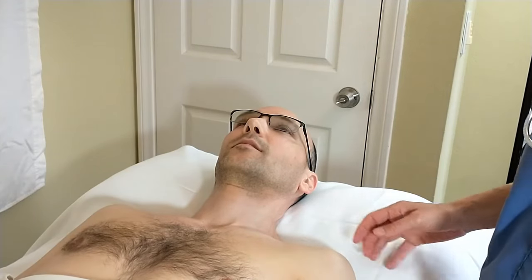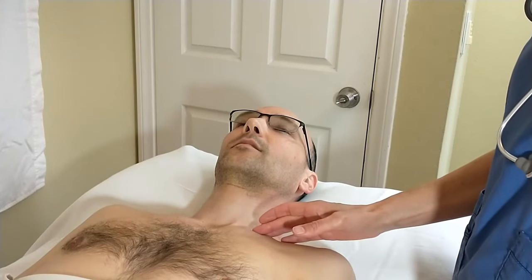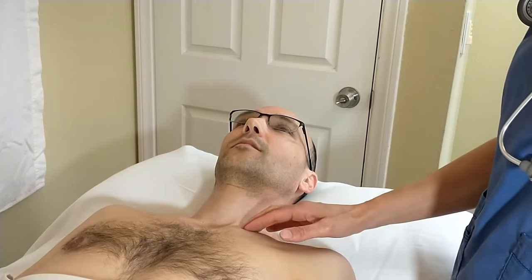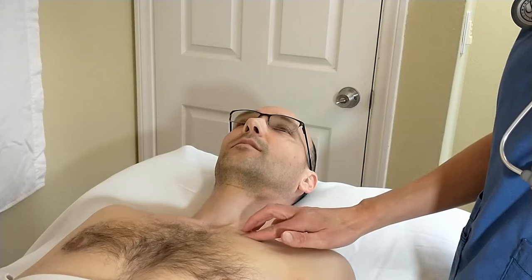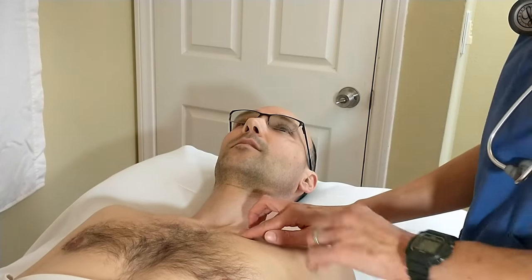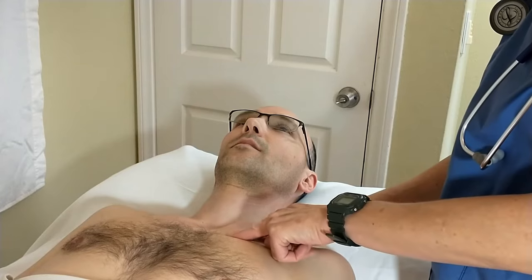So in order to find the correct landmark, I start by looking at and palpating the patient's clavicle. The first rib actually lies right underneath that clavicle. So if I run my fingers across or over that clavicle, I find the soft spot in between, which is the first intercostal space. Then I march down and I find the second rib here.